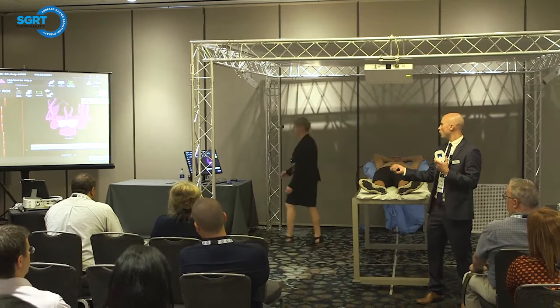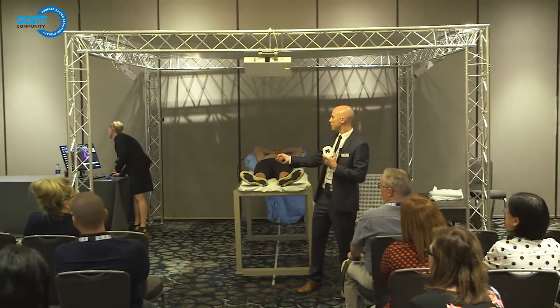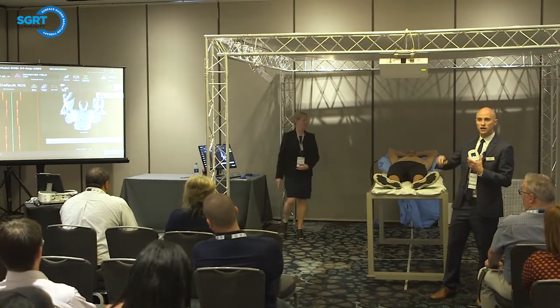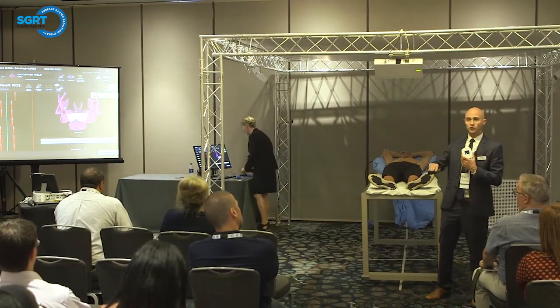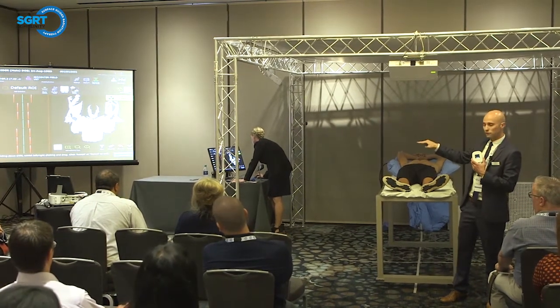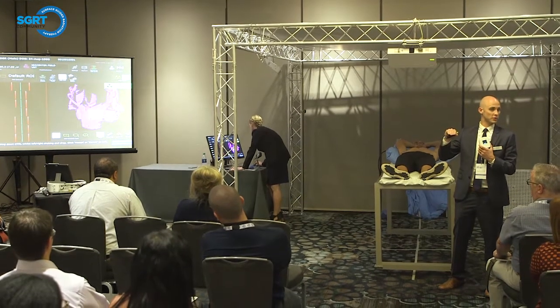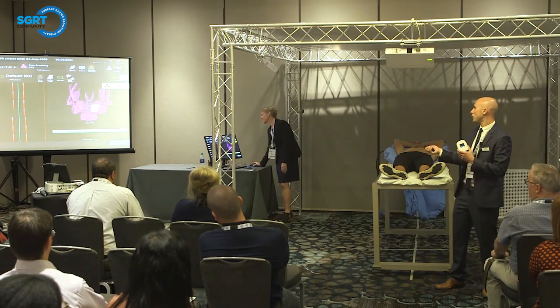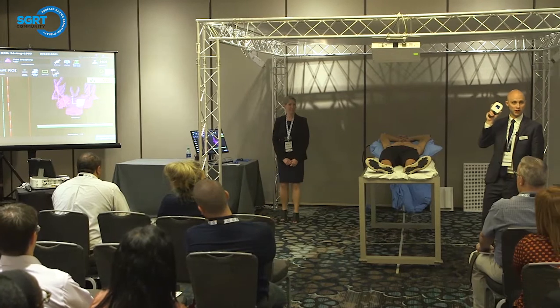So I'm just going to talk about this plotter. You have this white bar, which represents the patient's vertical threshold. You have the colored bar, which will go between yellow and green and move up and down based on the patient's breathing. The goal is to have the patient take a breath in and the colored bar reach the middle of the vertical threshold and hold it and sustain it for the duration of the treatment. Regardless of which 2D plotter you have up here, it will always display as the coaching plotter on your device.